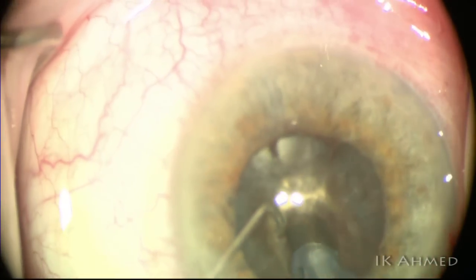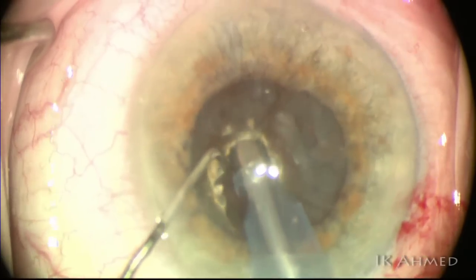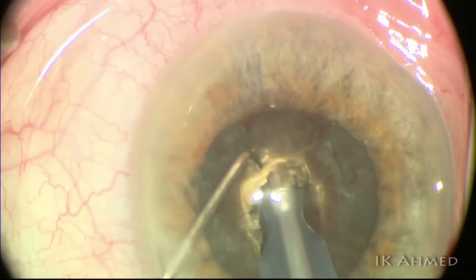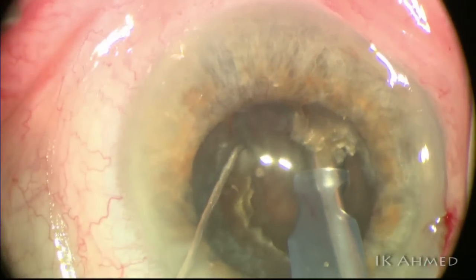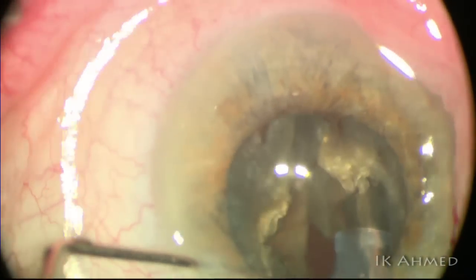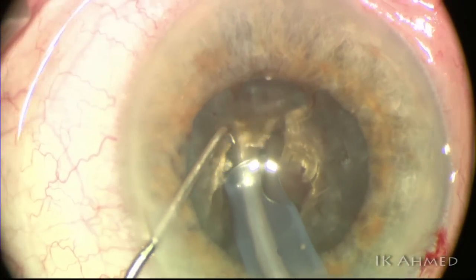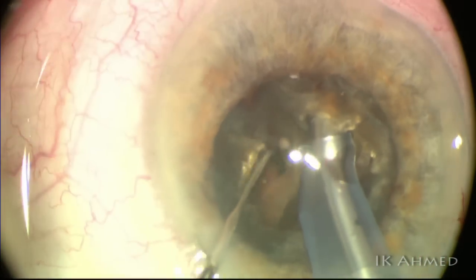We're using a 1.1-millimeter large Kelman flare tip, which we find very efficient in managing these cases. The large bore opening is effective, and the smaller neck helps to prevent surge, although one has to be careful to prevent tip blockage, which can occur with flare tips. Once deep enough, we engage under high vacuum with the nasal shelf that's been retained, then use our Nicomin vertical chopper to split across and propagate the tear posteriorly. Going straight to chopping is somewhat risky and may result in a posterior plate — instead, creating a nice deep trough, like a stop-and-chop, allows us to propagate the chop effectively. This is essentially a debulk chop technique.